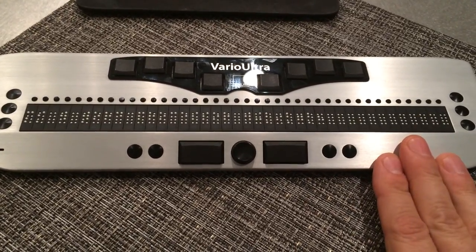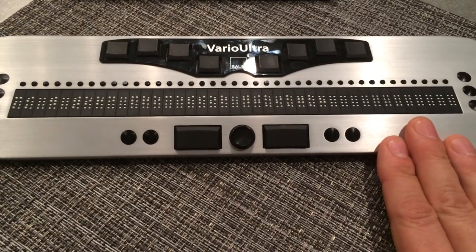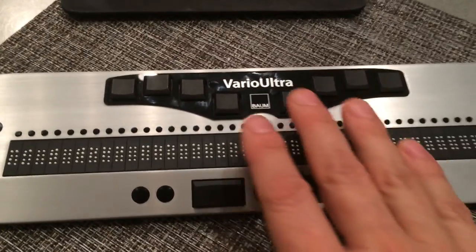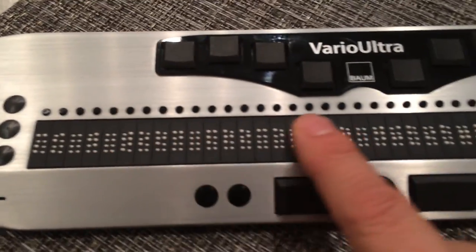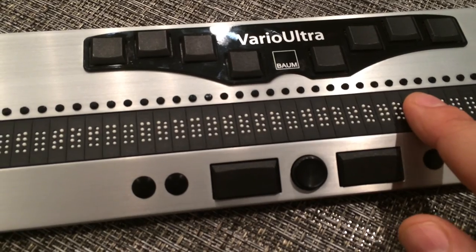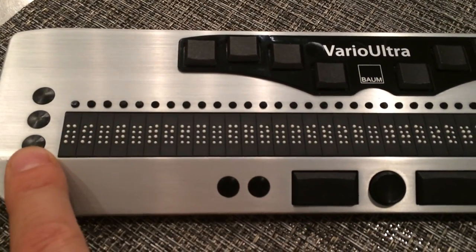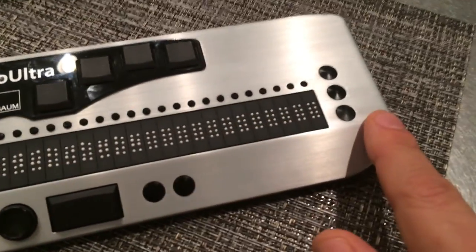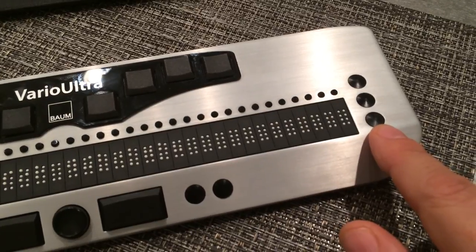Like the 20-cell, this model is made with brushed aluminum housing, which helps make it very light as well as being very strong. It features an eight-button Braille keyboard. There is a 40-cell Braille display, so twice as many cells as the other model. There are cursor routing buttons along the top. To the left and to the right of the Braille display, we have some flat buttons — there are three on each side.